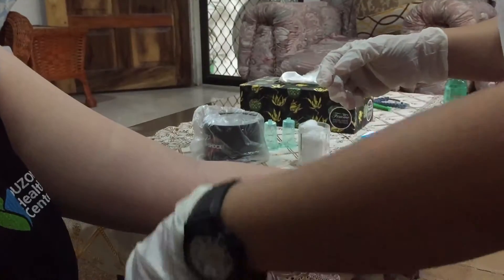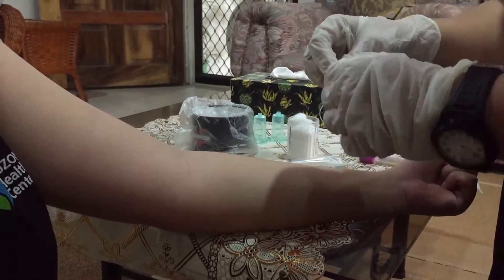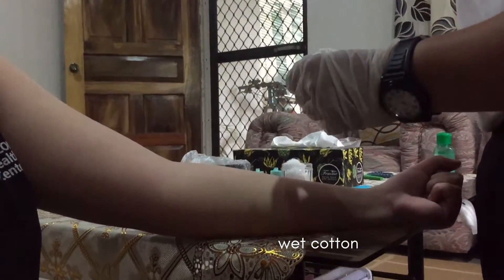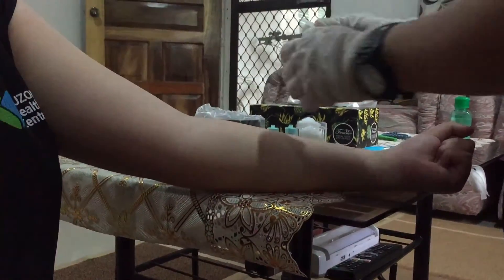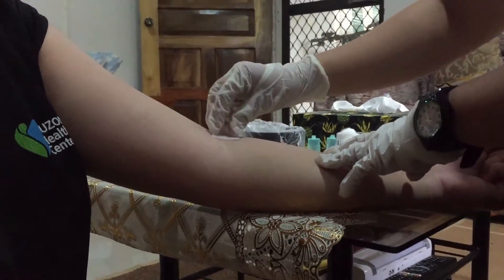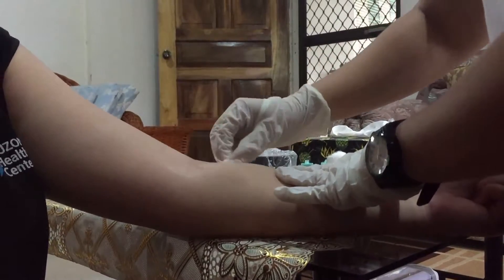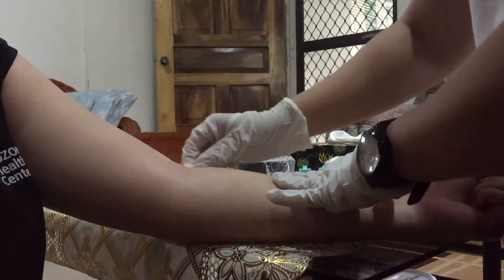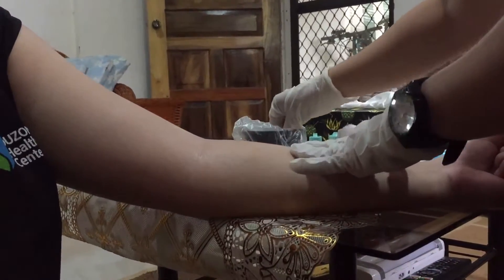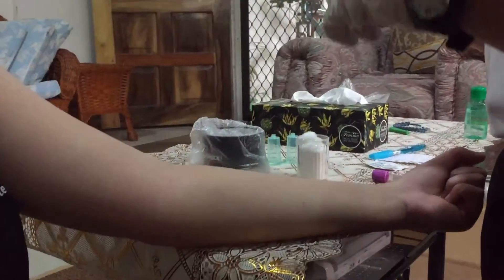After finding your vein of choice, clean the site with an alcohol swab or wet alcohol. The cleaning should be from the inside towards the outside to prevent contamination. You should clean with force, guys, to remove the patient's microorganisms. Do not blow on or fan the site.